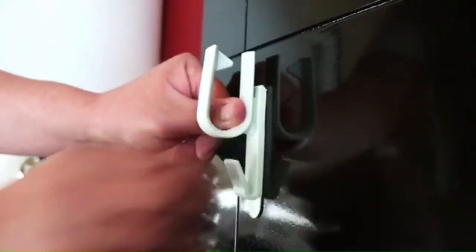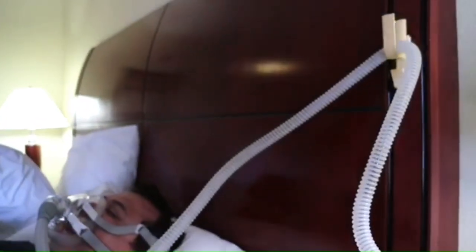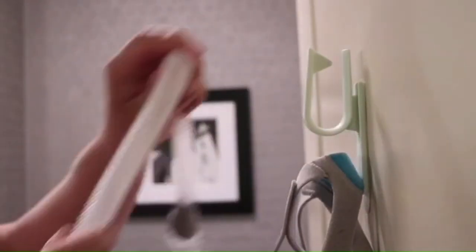Press firmly onto the clean surface for 30 seconds, hang your CPAP hose, and finally start getting quality sleep. The U-shape is designed to double loop your hose when air drying after disinfection.